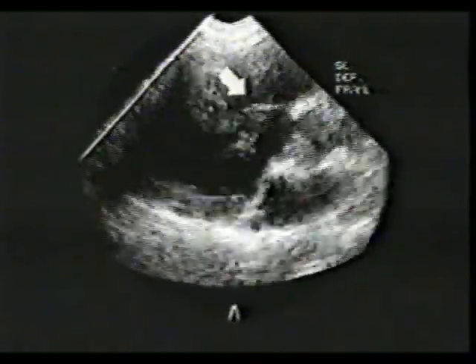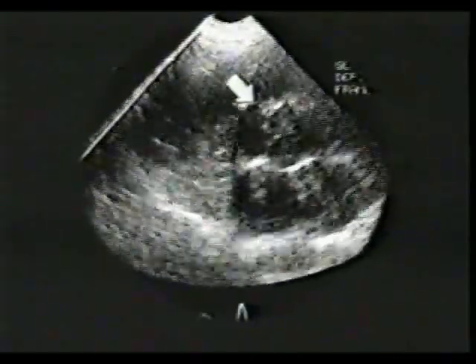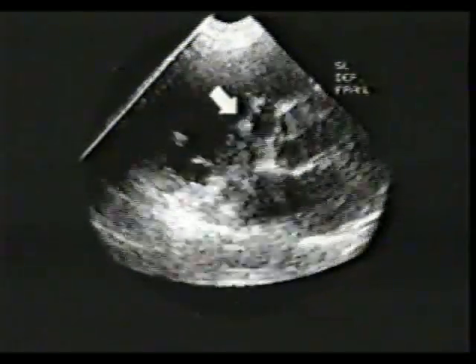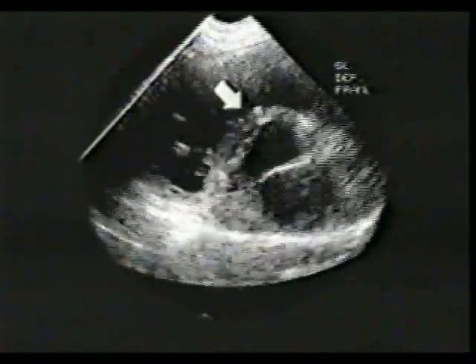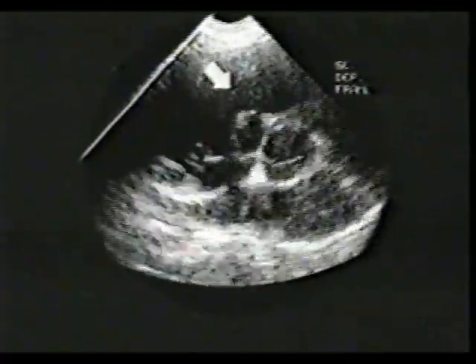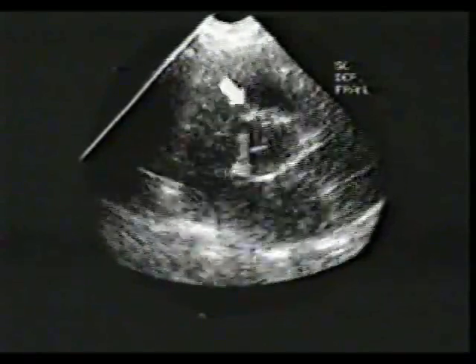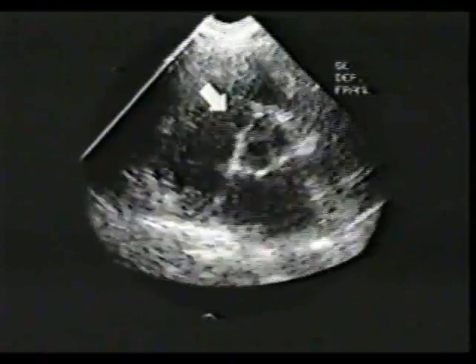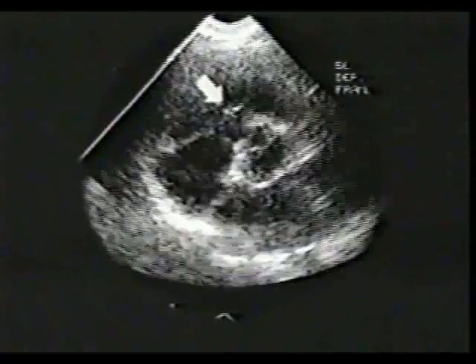You can now see that the aneurysm is partially covering the ventricular septal defect and there is opening evident right at this position through which residual shunting was still present. Now, as the scan is being rotated into the short axis plane, here's the aortic root with aortic valve, and a large aneurysm of the membranous septum can be clearly visualized with small residual defect present.